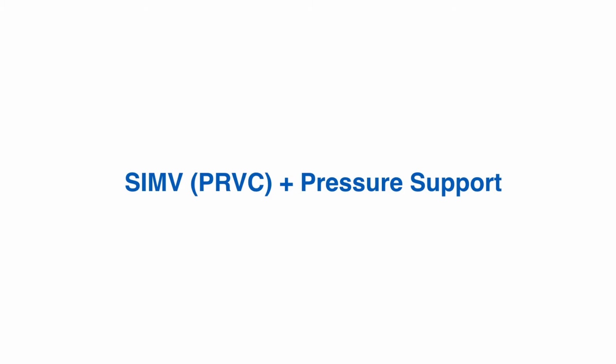So this mode tends to have all the advantages of the previous one. You've got your set tidal volume, so guaranteed ventilation. You've got a decelerating waveform, which is more comfortable for the patient, and also results in lower peak pressures than you'll get with volume control.